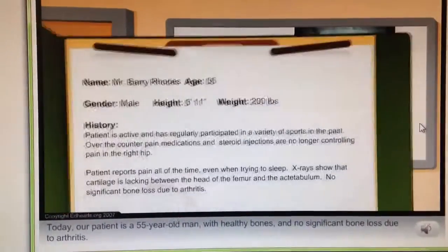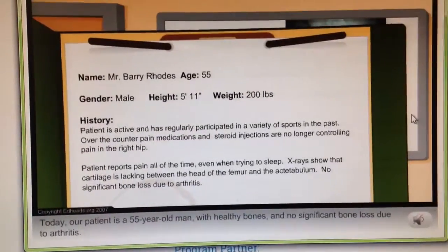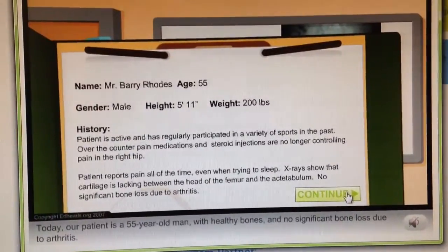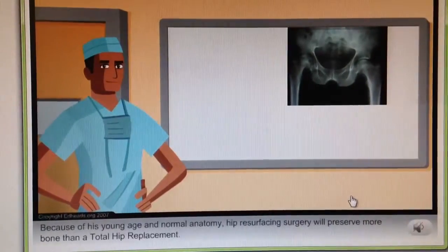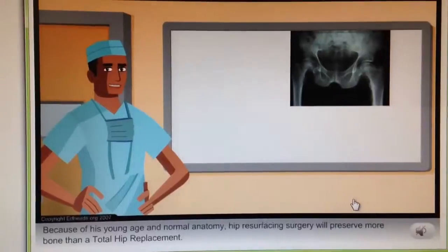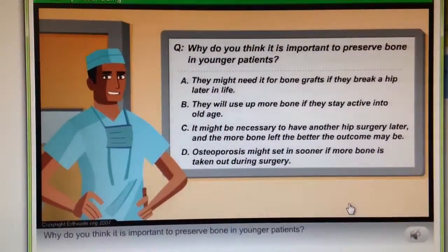Today, our patient is a 55-year-old man with healthy bones and no significant bone loss due to arthritis. Because of his young age and normal anatomy, hip resurfacing surgery will preserve more bone than a total hip replacement. Why do you think it's important to preserve bone in younger patients?